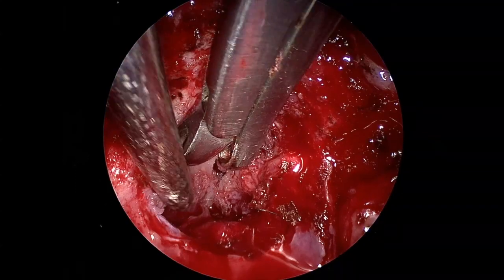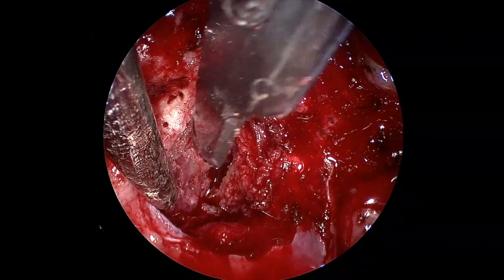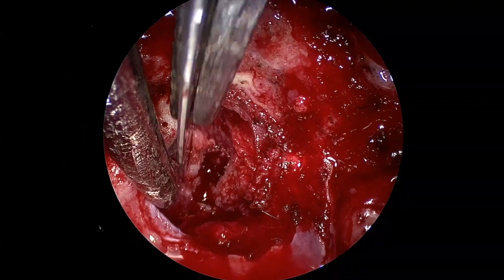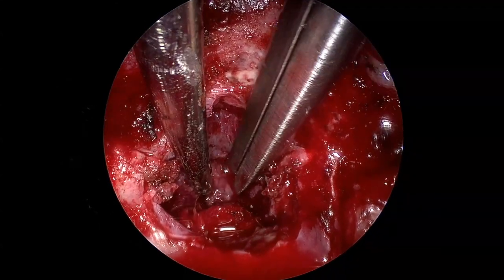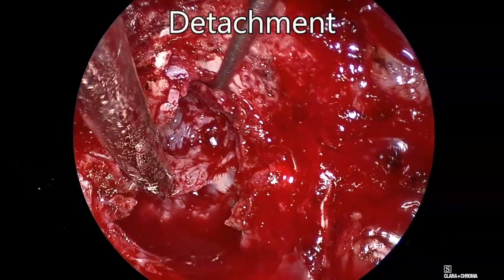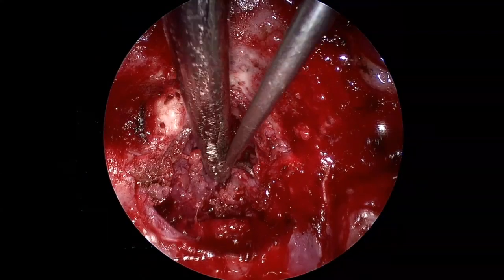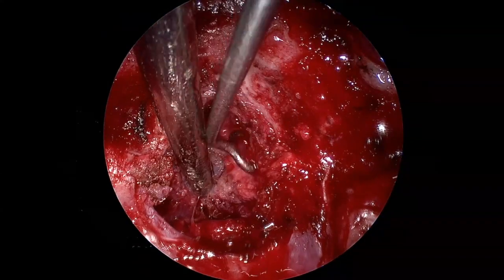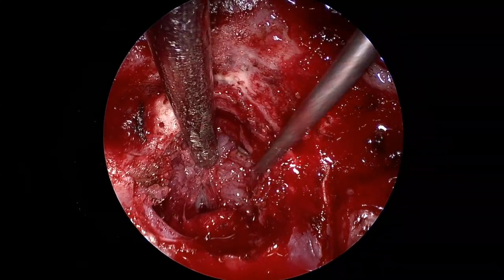Henceforth, a 30 degree scope was kept on the floor of the right nostril, angulated upwards, and fixed on a rigid holder along with an irrigation system, while suction was positioned cranial to the scope and other instruments were inserted through the left nostril. After coring the central portion, the lateral and anterior parts of the tumor were gently disconnected from the surrounding dura.